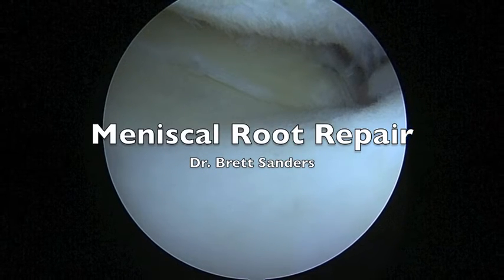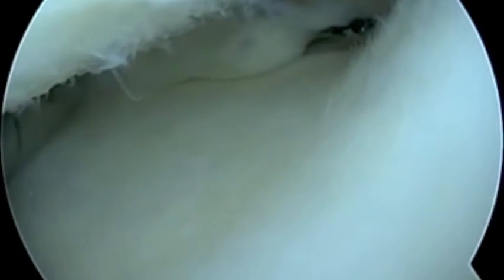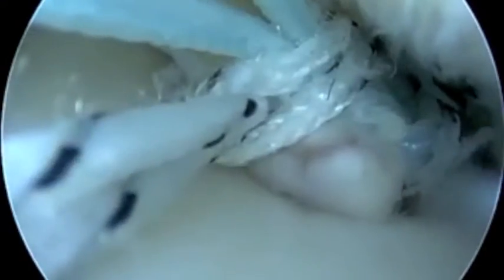Here's a technique for a meniscal root repair to salvage this unstable meniscal root tear. You can see how the meniscus can be pulled away. We've placed some sutures there in a cinching configuration into the good tissue — actually put two sutures here.